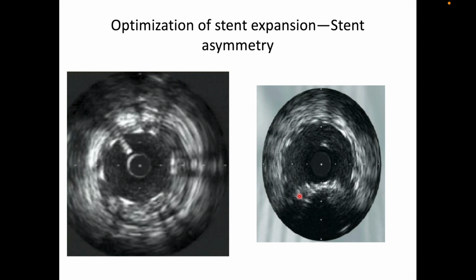Your stent struts cannot be seen touching the adventitia unless you have stented a normal artery. So we are only expanding the lumen area. What you need is that the stent should be fully opposed, that is touching intima at all areas and well expanded according to the calculated area as per the distal reference segment or 80% of media to media. Don't worry about the plaque that is seen behind the stent.